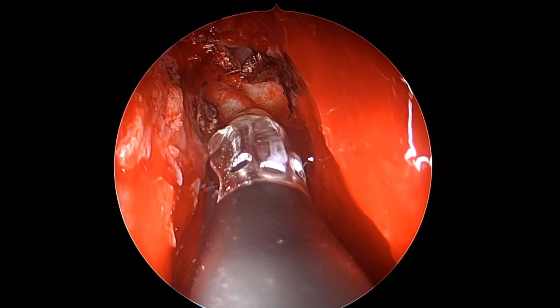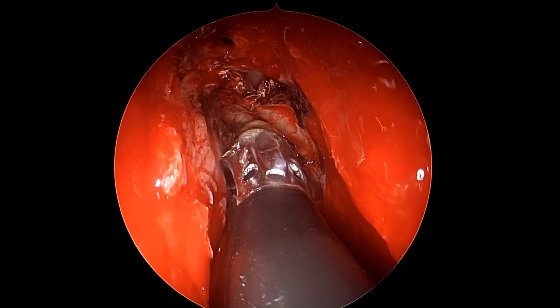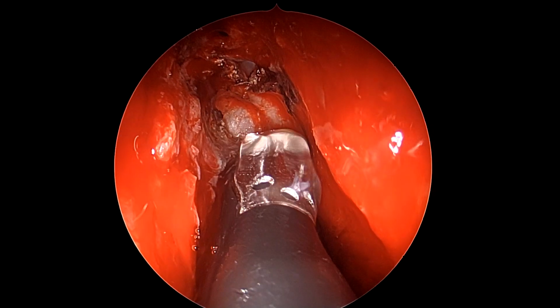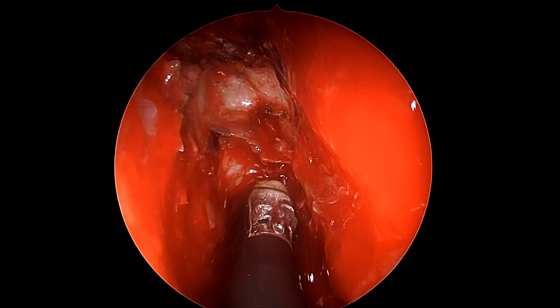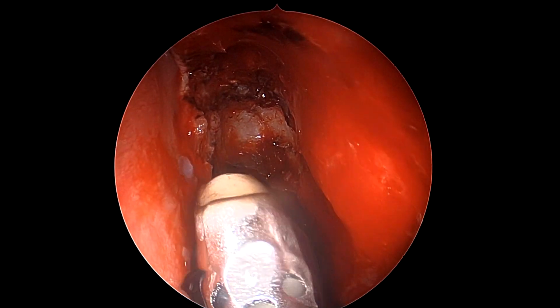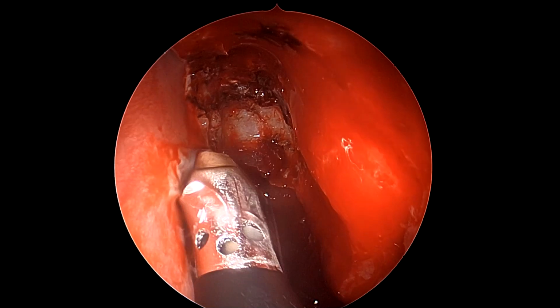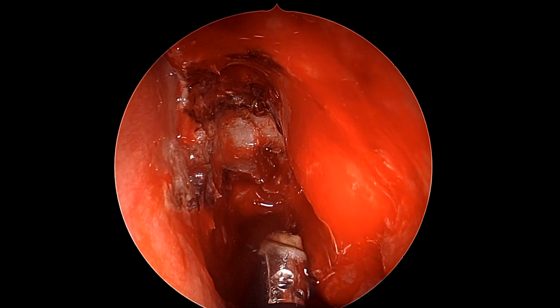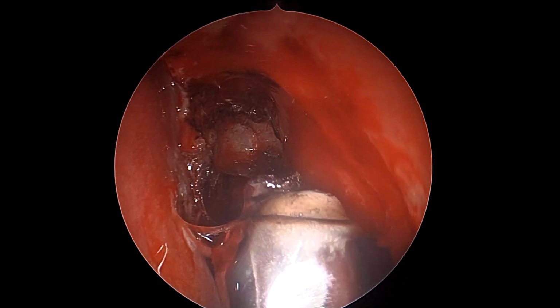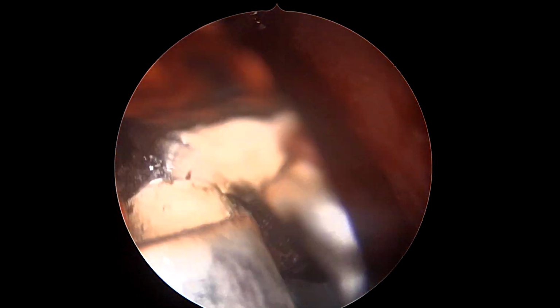And once we have resected the middle turbinate, then we use our coagulation wand to achieve hemostasis as well as ablation of the residual mucosa around the defect, as well as coagulating it so that the entire area of bone becomes bare for a graft placement. The plan here would be to use a fat plug to plug the defect, as well as using a layer of fascia lata or temporalis fascia to place on the defect site, followed by a free mucosal graft from the middle turbinate.